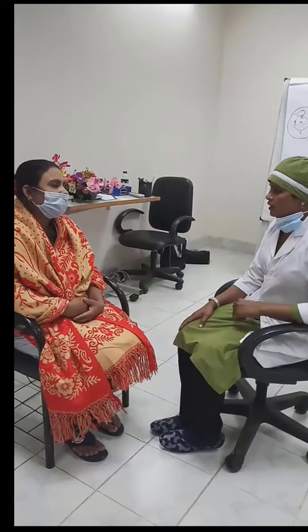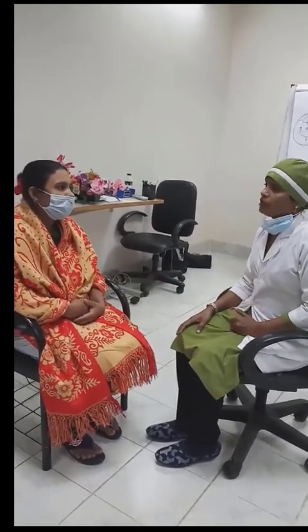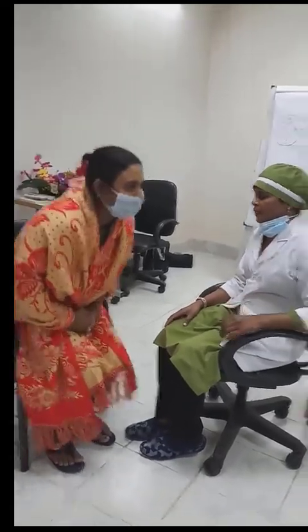It can be done in a simple outdoor procedure. First, the patient should evacuate her bladder, and the patient is placed in the lithotomy position.